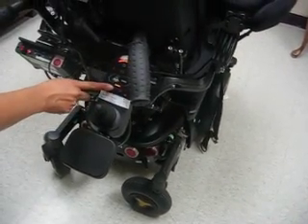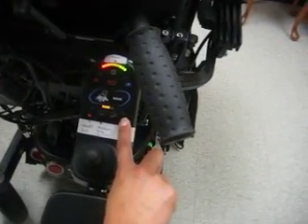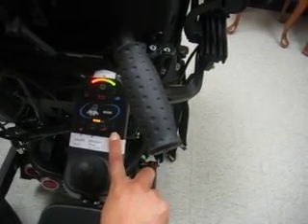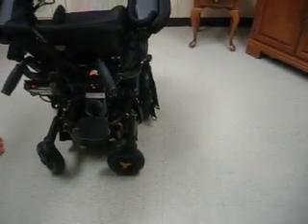Turning attendant drive on and pressing tilt. If it goes in the wrong direction, press again. Turn the chair off.